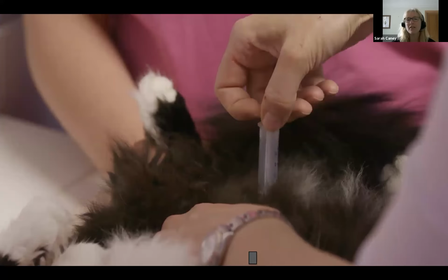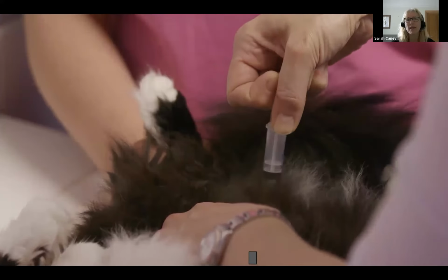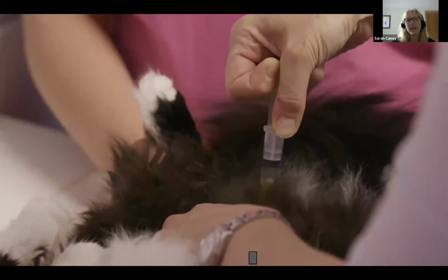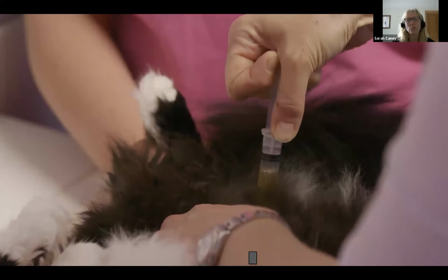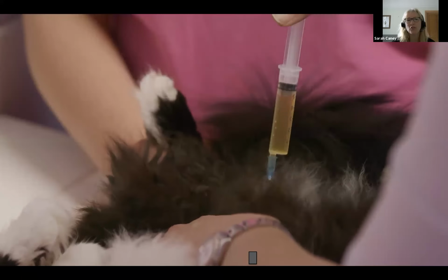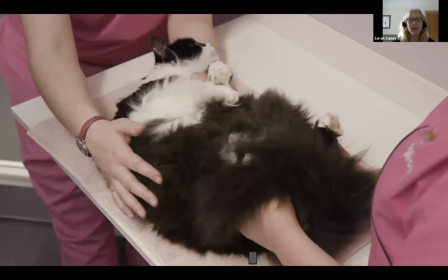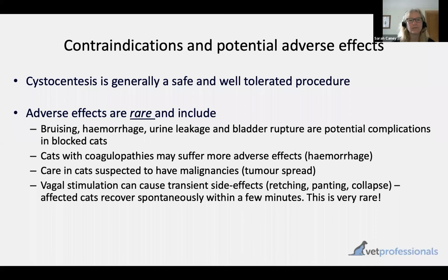But another example of a cysto, he's lying on his back, sadly not the best of views via this video, but again you can see hopefully that he's just being very gently held, and the sample is pretty straightforward to collect. Luckily with him, even though he's very big, we were able to get a sample quite easily.